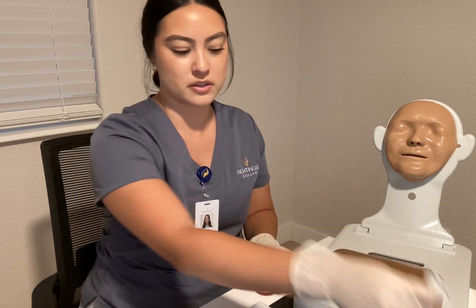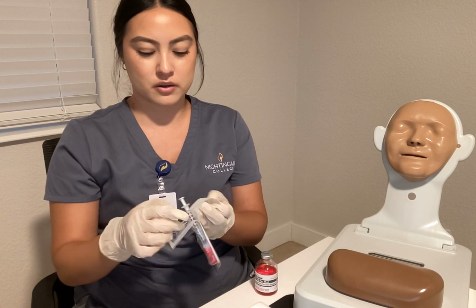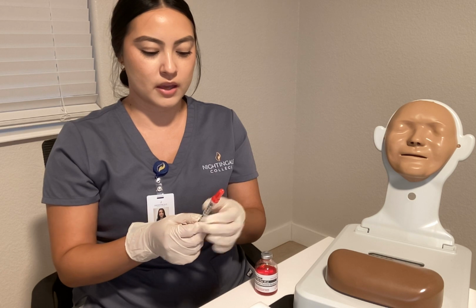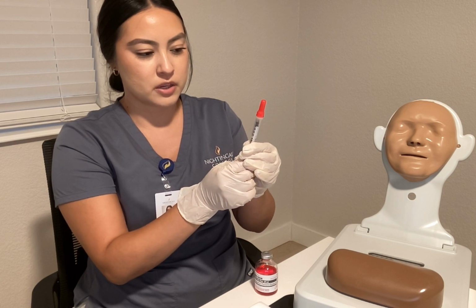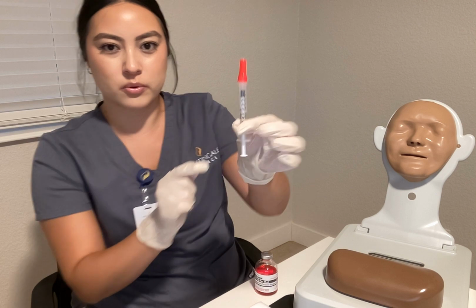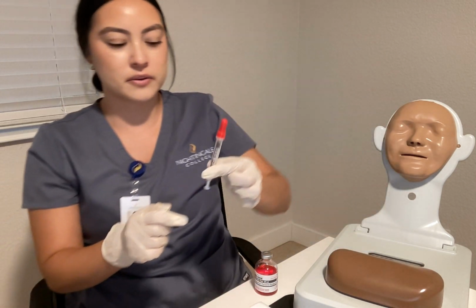We go ahead and discard this into our trash. Next, we're going to open our syringe. Before we take off the cap, we're going to draw up air so we can inject into the vial, and it's going to be 0.1 that we inject air into the vial.